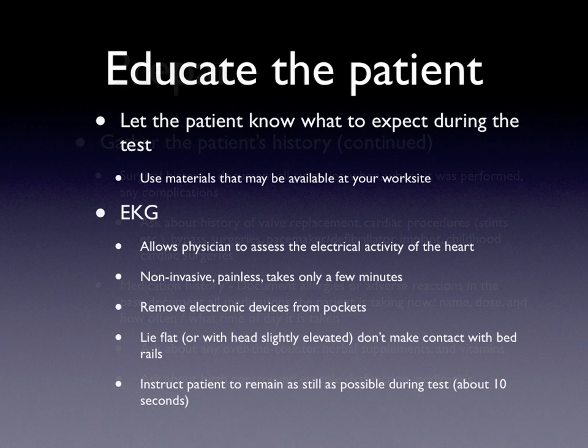Next, we need to educate the patient. Let the patient know what to expect during the test. Use any materials that might be available at your work site. I know here in Rochester at Mayo Clinic, there's a nice little threefold brochure that patients are given before they have almost any test. Sometimes it's even a complete booklet that will tell them what's going to happen. Oftentimes it's sent to them in the mail. Again, I don't know from workplace to workplace how that'll happen.